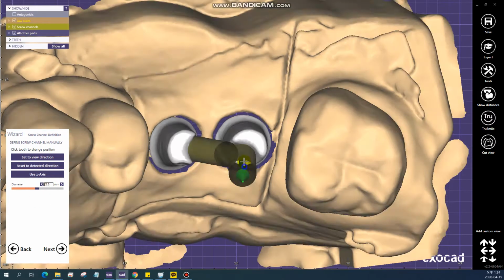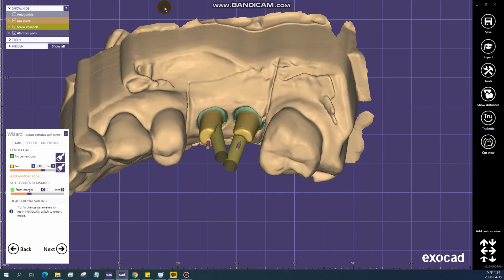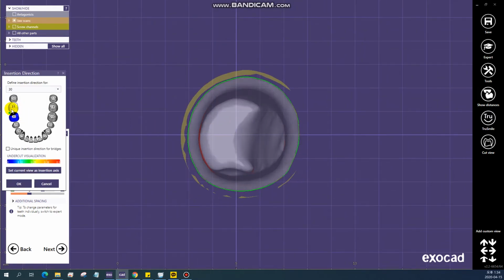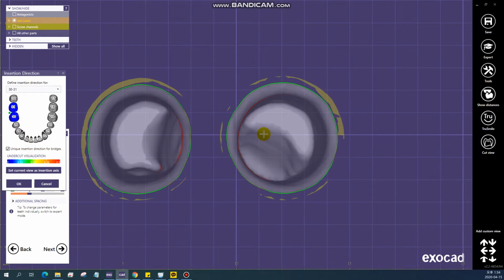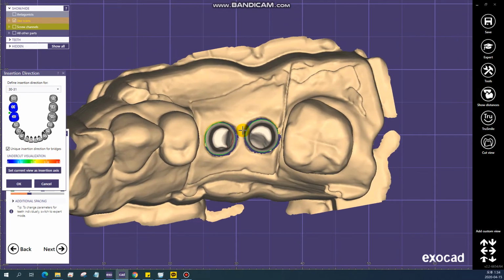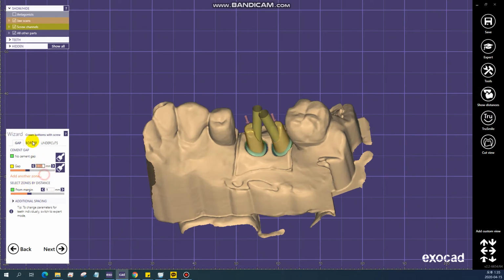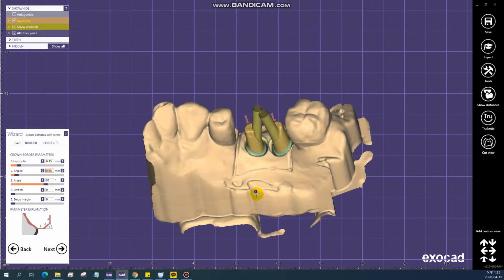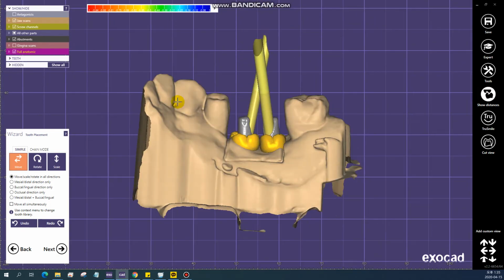When I change that, number 25, number 2.5. And also, before you go forward, you have to see the angles. If you have a 5-axis milling machine, and normally these days everyone has that, then when you fit in the model, this is the best way to save your time for insertion, and even milling, you can save time. Okay, here are the parameters that I always put in like this. You don't have to follow it; you can follow your own way. You don't need to follow anything from me.